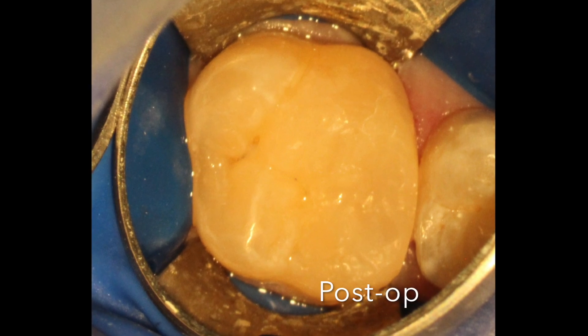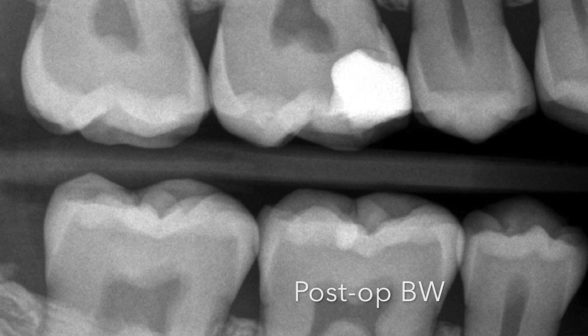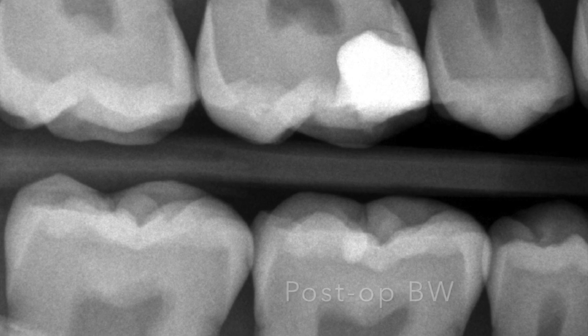Isolated the tooth with contact matrix, flowable at the box, nice packable composite, checked the occlusion, and a post-op bite wing showed we didn't get close to the nerve. Thank you and leave me your comments.